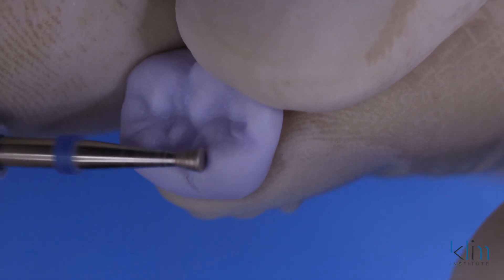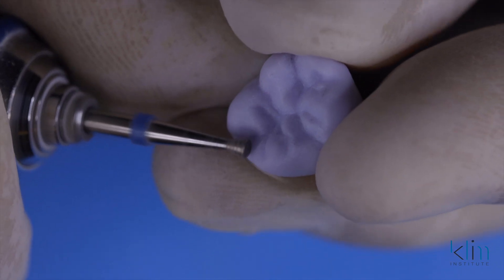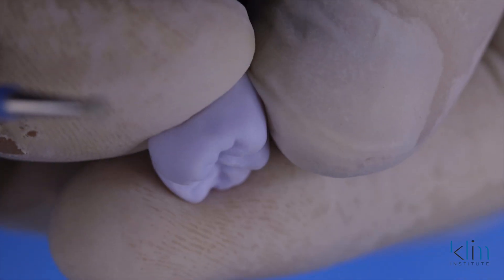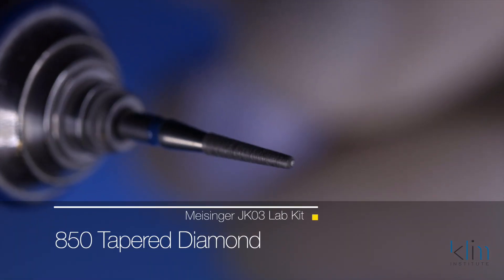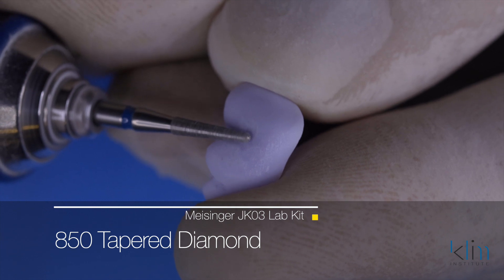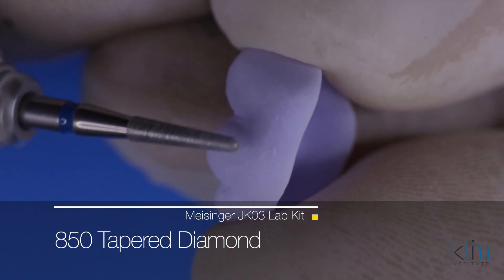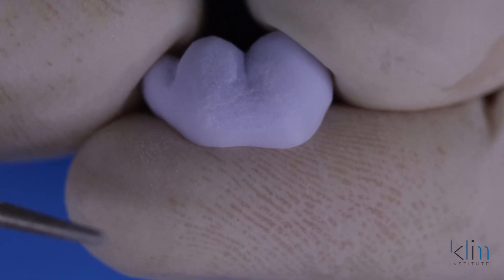The morphology we can achieve is defined by how much occlusal reduction we have. In a case like this, the cone burr on the right side of the milling unit doesn't mill down to what you actually see on your screen — the angle of that cone burr is around 33 degrees. All we're doing is adding back the true definition that was created in the virtual design. The 850 diamond is my workhorse both posteriorly and anteriorly. Here we're using it to create subtle refinements of the grooves and some perikymata if needed — that's just a bounce of that burr across the ceramic surface with a really light touch.